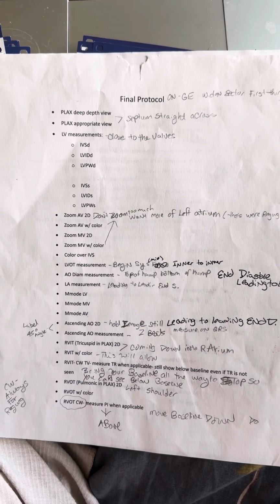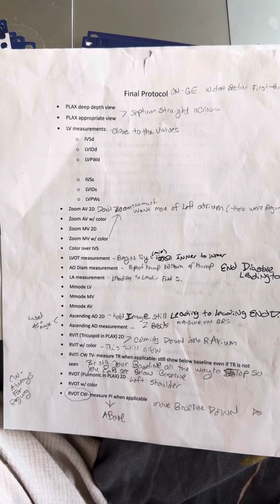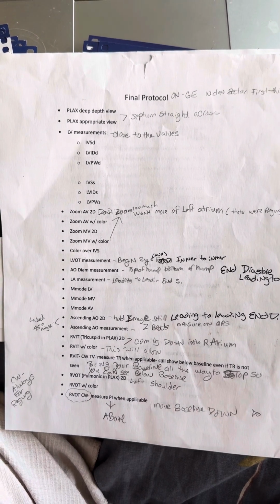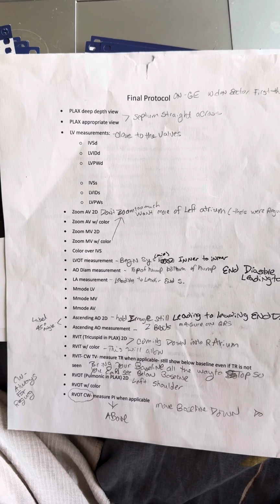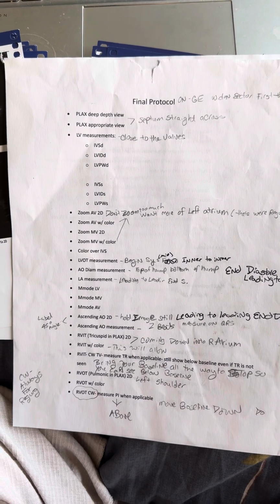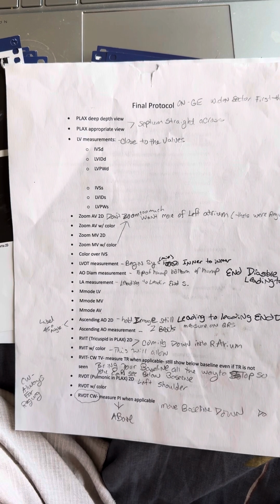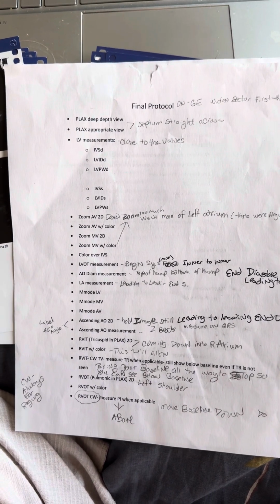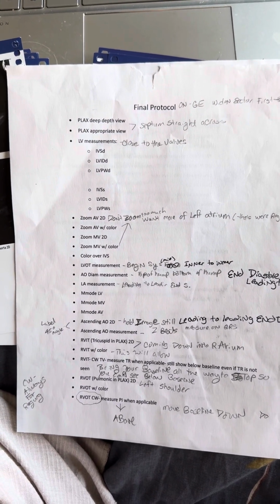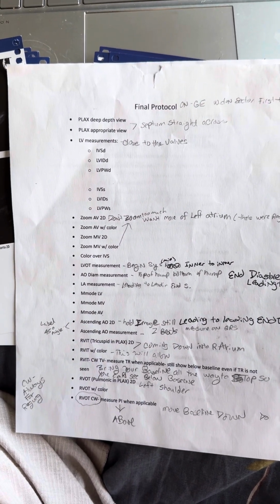Next will be your RVIT, which is your tricuspid, and you will color that. You should see it coming down into the right atrium. In RVIT, you put a continuous wave and you bring your baseline all the way to top so you can see below the baseline.